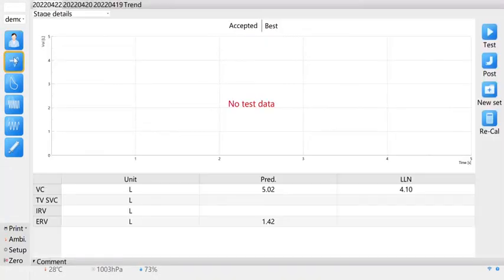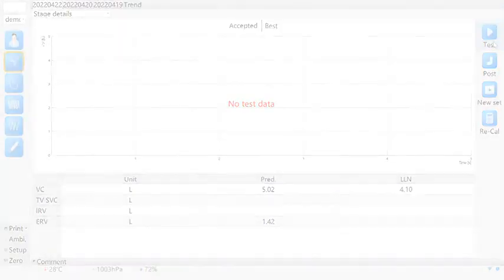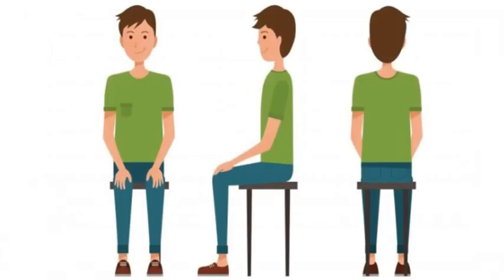Click the second icon on the left to wait for the sensor's zero calibration to succeed, and then enter the SVC test mode. Before the test, the patient's body should be in a vertical sitting position, wearing a nose clip or pinching his nose with his hands, with a filter in his mouth. His teeth can't block it, and he breathes with his mouth all the way. Click Start Test, and then click Test.